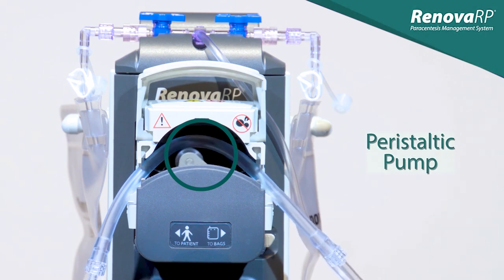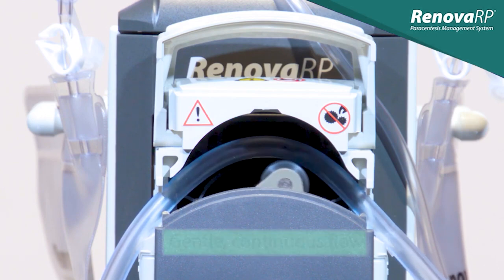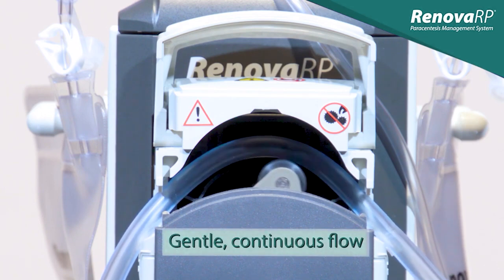Peristaltic pumps are fairly common in the medical setting and can be found in such devices as infusion pumps and dialysis machines. The Renova RP Pump employs this same peristaltic mechanism to draw ascitic fluid from the body with a gentle, continuous flow.